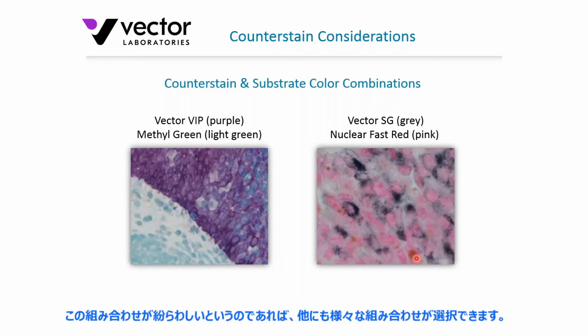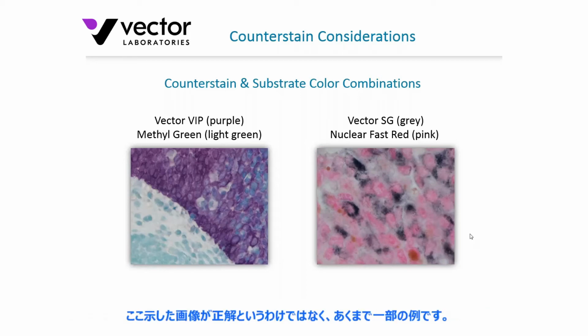So those of you who might be looking for alternatives to what you're currently using, or to mix it up a little bit, there are certainly a number of different combinations you could use. These examples here are just to give you an idea of what is possible, what is acceptable, what gives you a great contrast out there. Not exhaustive by any means, but just gives you some insight into other color combinations.